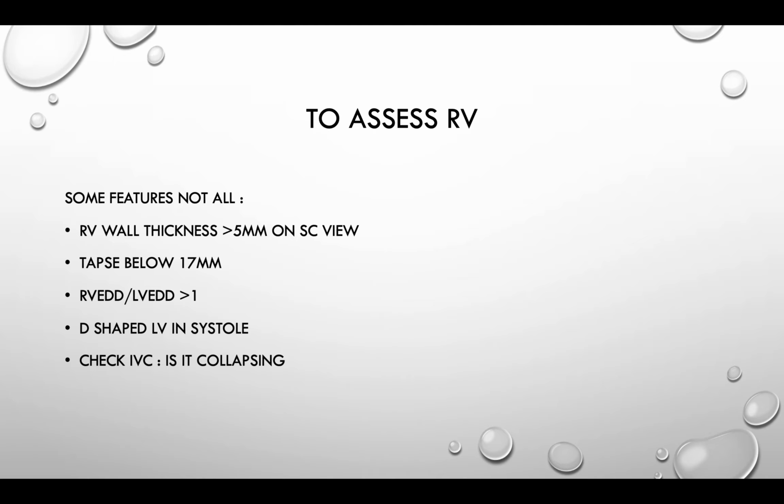And never forget, check your IVC. Is it collapsing? Obviously, it's not a direct marker of everything, but it is helpful in combination with other features that you see.